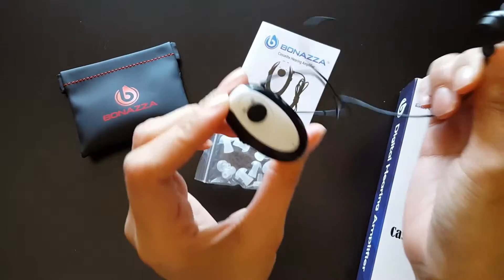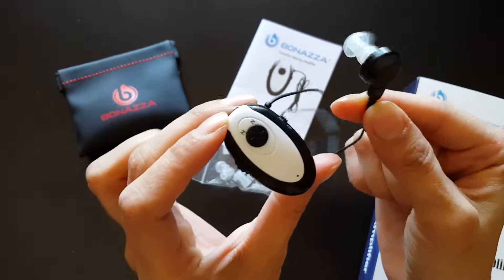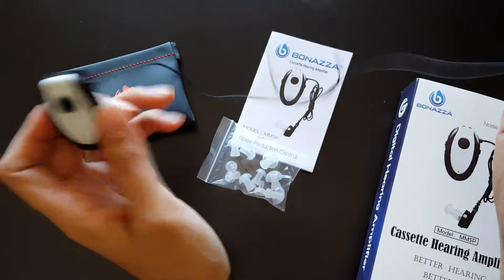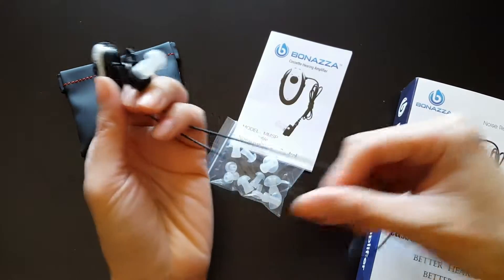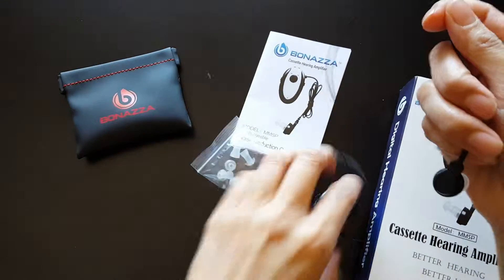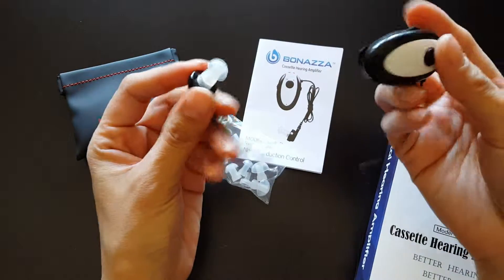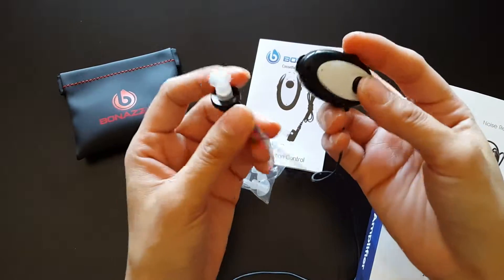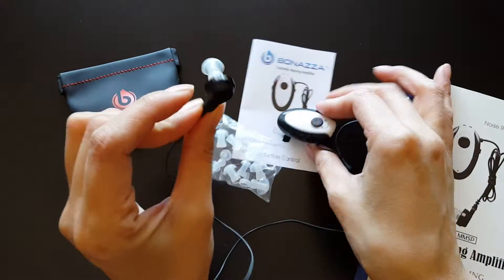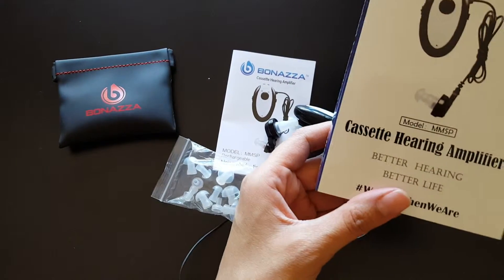Let everyone else in your house know that you're wearing it, because if they talk loudly or yell, it can get pretty loud in your ear. Overall, I think it's a pretty good product — obviously it's not a personalized custom hearing aid, but it's definitely something to help you if you're just not hearing things clearly and don't have the money or time to go to the doctor. I would definitely recommend it — you'll find the links below on where to buy it. It's on Amazon, and again it's the Bonazza Cassette Hearing Amplifier. Thanks!